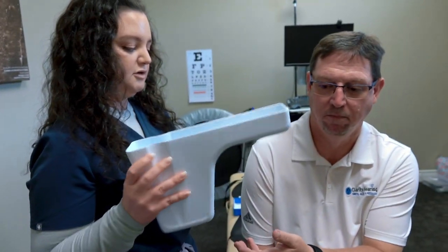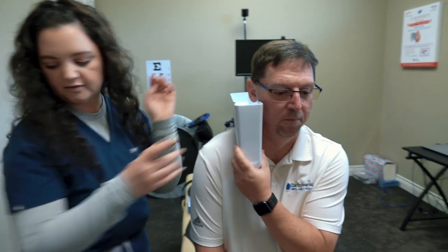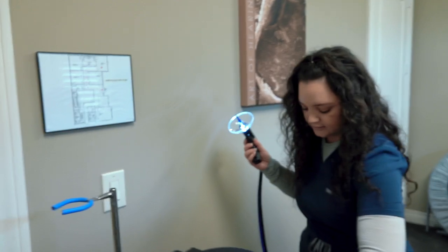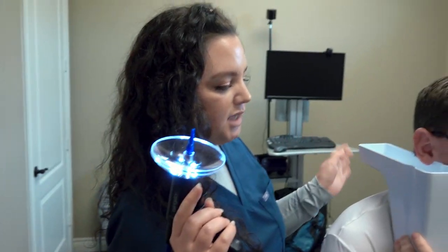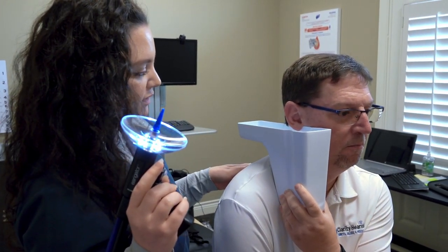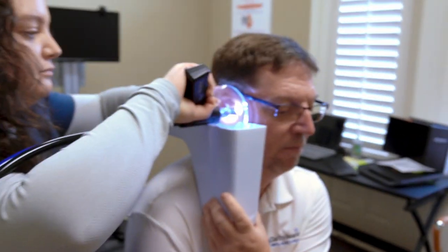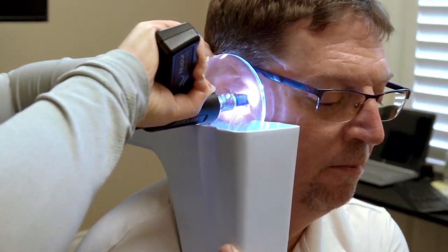I'm going to get you to assist me. You're going to hold the basin with your opposite hand — perfect, right up to the earlobe, that's perfect right there. This is just going to gently flush the wax out of your ear. I'll start out slow but depending on how difficult it is to come out, we may need to apply a little bit more pressure. Just let me know if anything is uncomfortable and we will readjust. Ready?